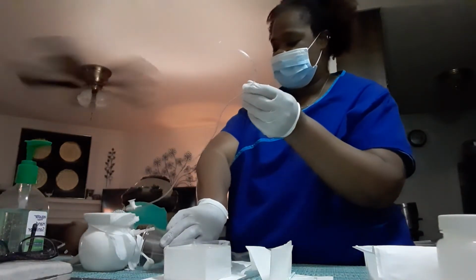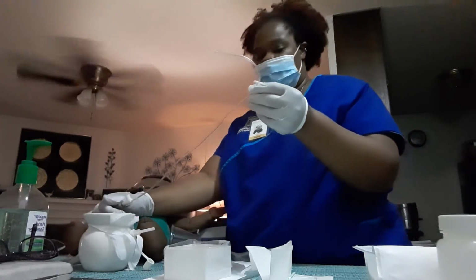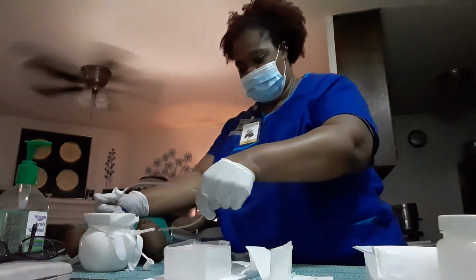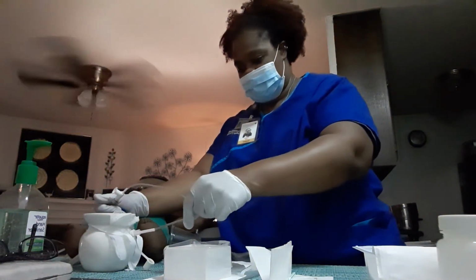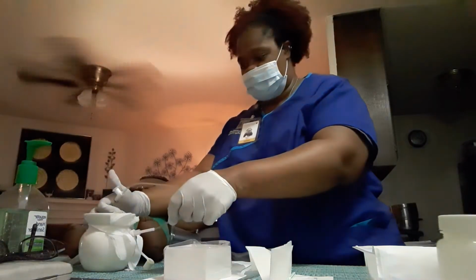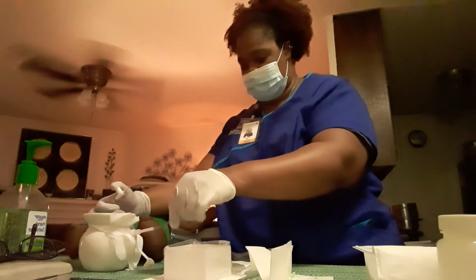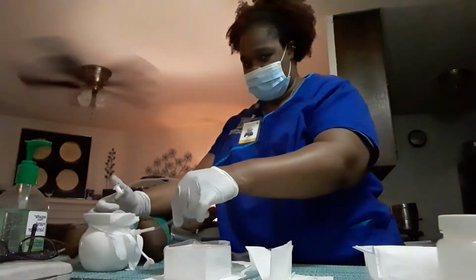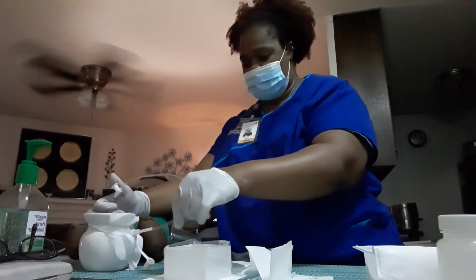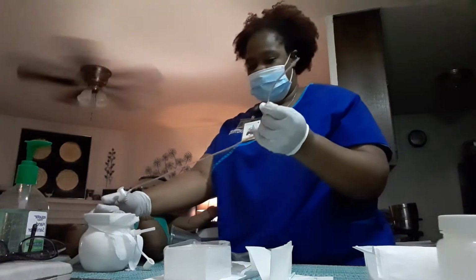You doing okay, Mr. Chamberlain? We're going to do this one more time, okay? So I'm going to insert the tubing. I've met some resistance. The patient is coughing. I'm going to start intermittent suctioning again. After about 10 seconds, I'm going to start withdrawing. Okay.